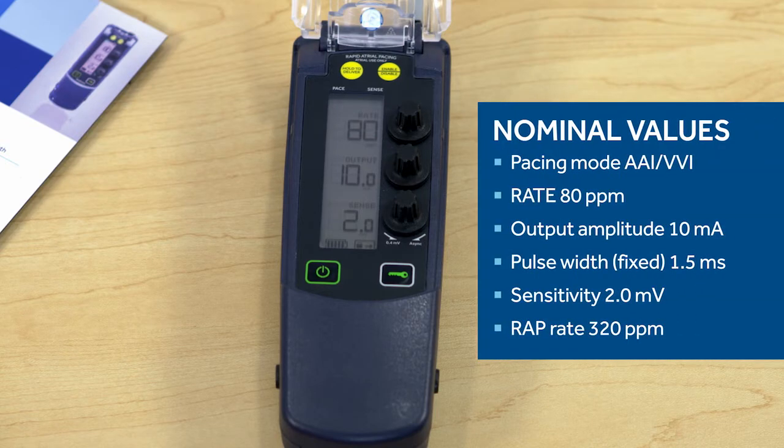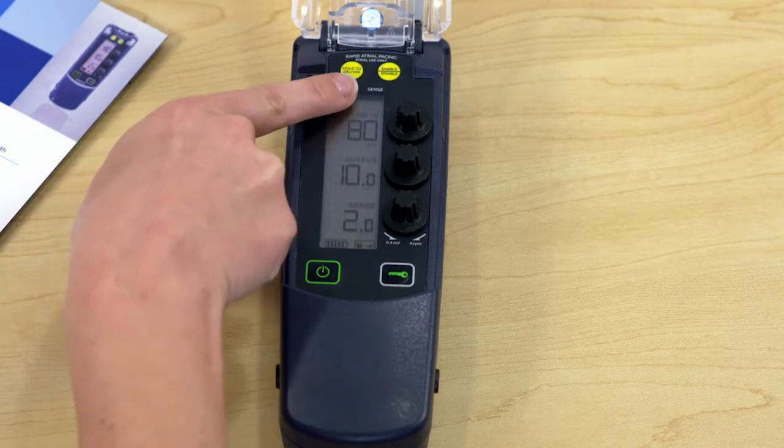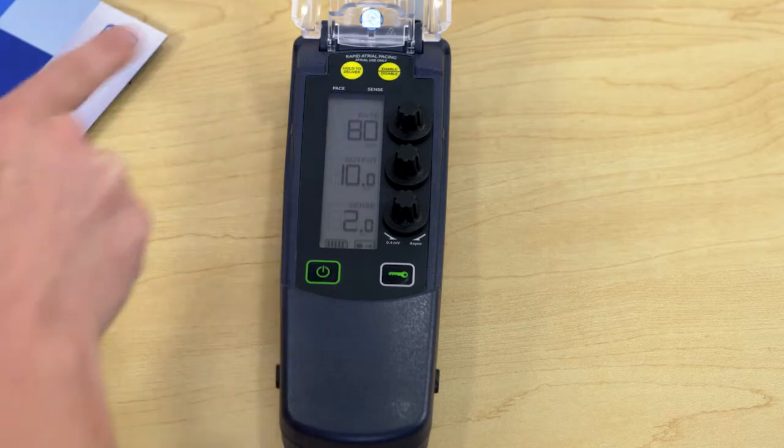These are the nominal settings the device will automatically go to when it is turned on. There's a flashing green light — does that indicate pacing? Yes, and there's a blue light that indicates sensing on the right side of the screen. That's great. You can see at a glance what the device is doing while also watching the heart monitor.